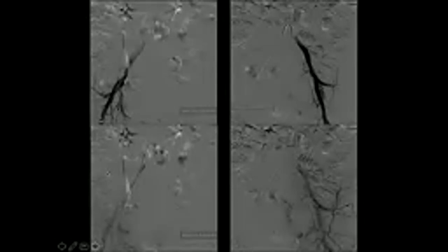Or you need to look at the sacral group. This is the paraspinal AVM. It is really impossible to reach there by transarterial route. By using transvenous route, you can come to the point here and just glue it. That's easy. The difficult part of the treatment is reaching that point. And this is post-embo.